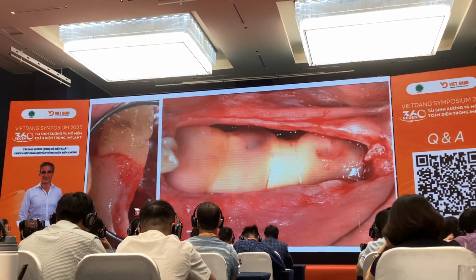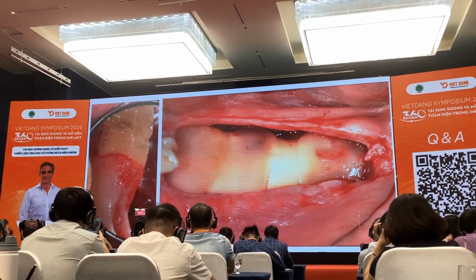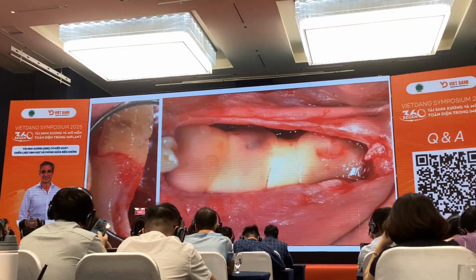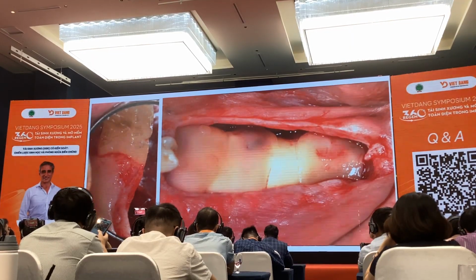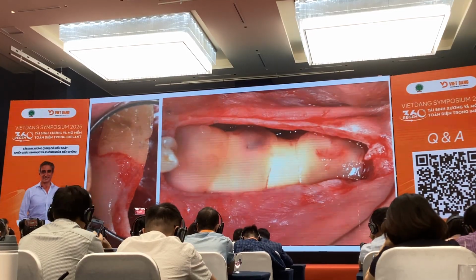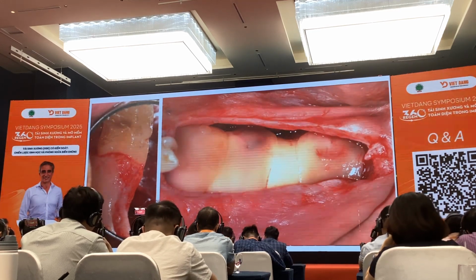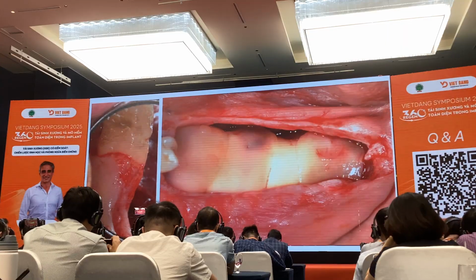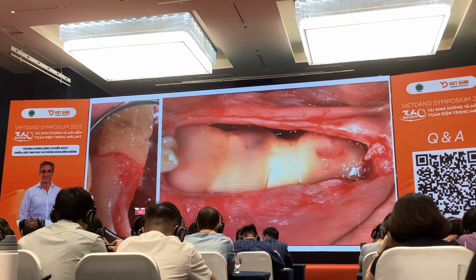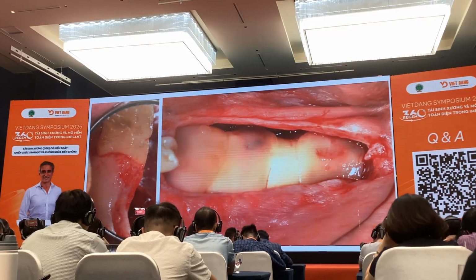Try to imagine that the head of the implant that you place at the time of the GBR is placed 1 millimeter more coronally than the residual bone peak. Or another solution, that the implant has been placed correctly, but the biomaterial I put in excess was over the top of the head of the implant, and the level of the membrane is higher than the bone peak.